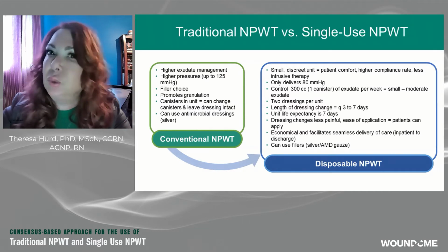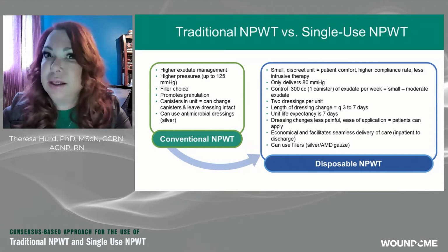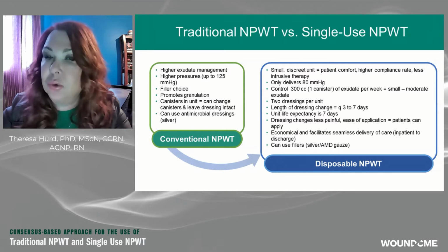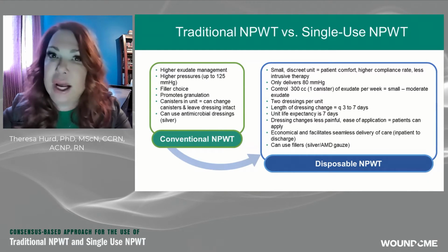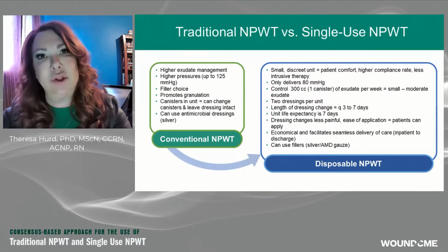So here was a really good population that from a compliance perspective, when I switched them to single negative pressure, I was able to deliver negative pressure to the wound, but at the same time, I wasn't giving that psychological impact by having to carry this big machine around high school where possibly people would look and there were body image issues.